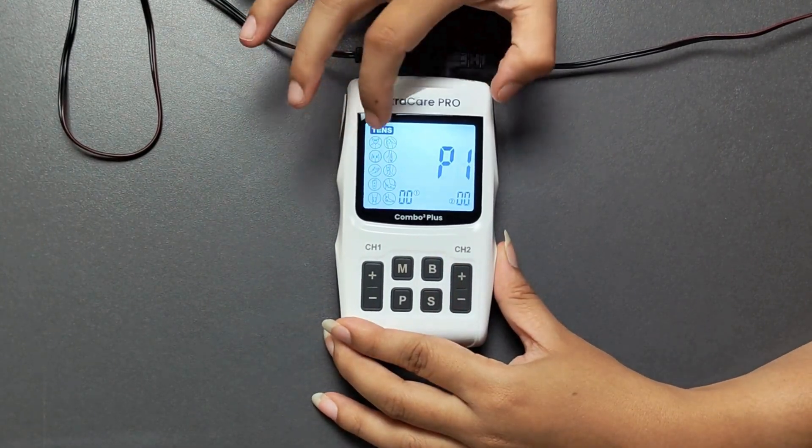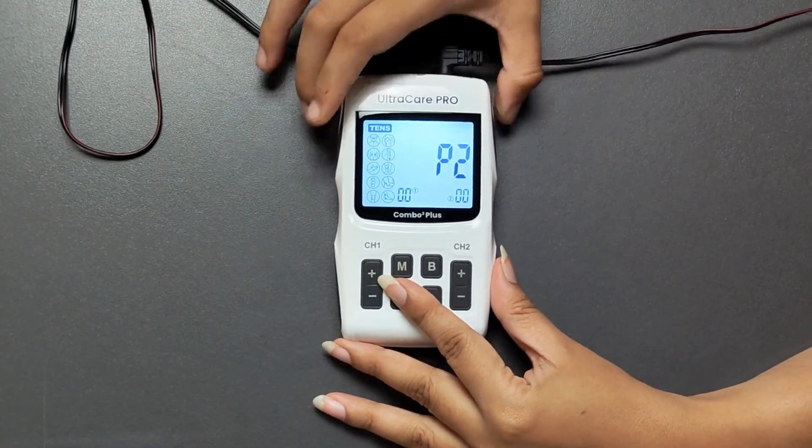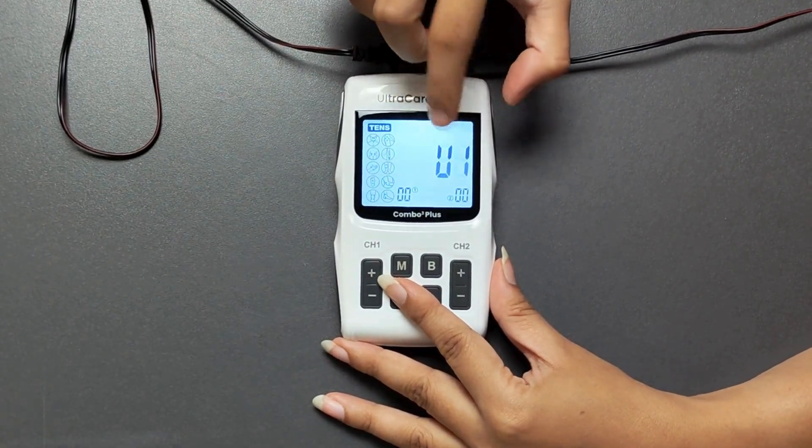Press B to select the desired body part and then press P to switch through the program types until you reach U1 manual mode.